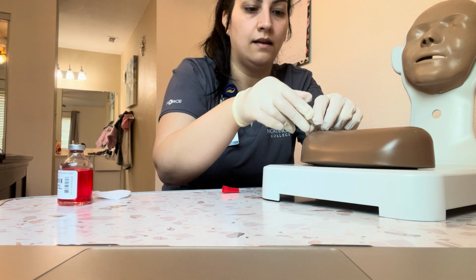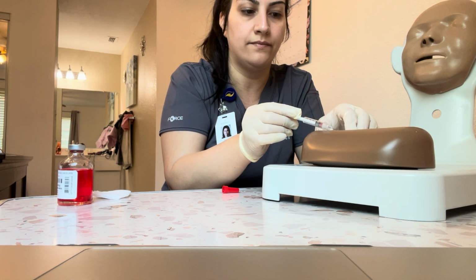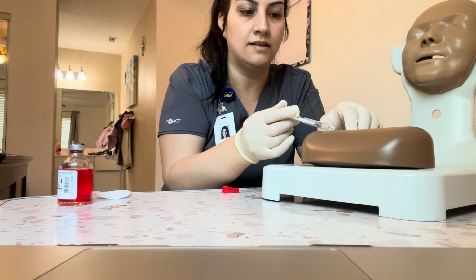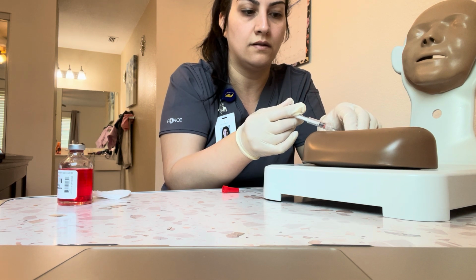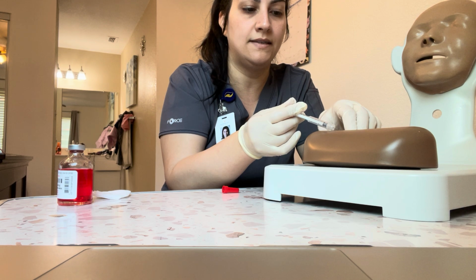I'm going to make sure that it's about 1/8 inch into the dermis. And I'm going to slowly inject. I do see a small bleb, 6 to 10 millimeters, resembling a mosquito bite.